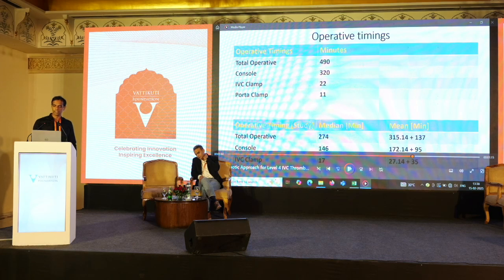In this case, the total operative time was 490 minutes, console time was 320 minutes, IVC clamp time was 22 minutes, and porta clamp time was 11 minutes. We have a case series of around 22 cases in which level 2, 3, and 4 thrombus are included. The median total operative time is 274 minutes, and the median console time is 146 minutes.